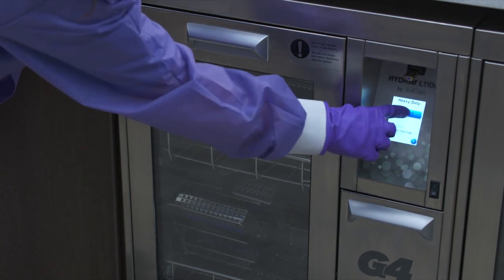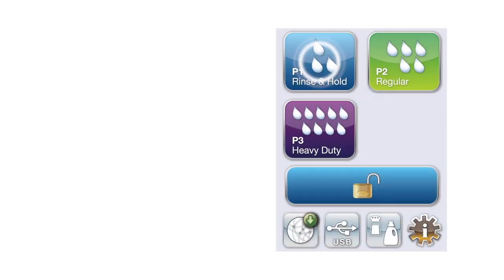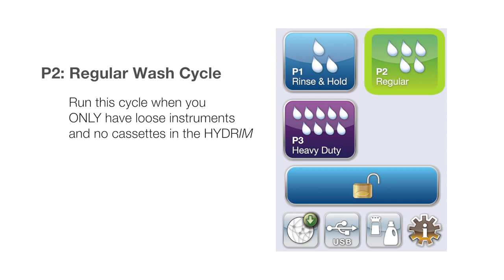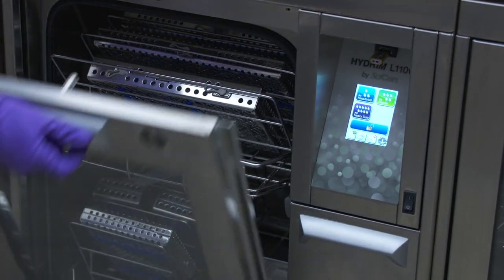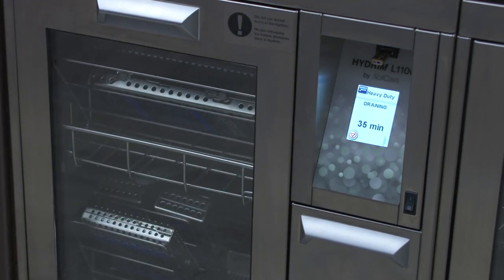Make sure you hear a solid thump as the door closes. The Hydrum comes with three pre-programmed cycles: P1 Rinse and Hold for rinsing off heavy debris or keeping instruments wet; P2 Regular Wash Cycle, for loads with only loose instruments and no cassettes; and P3 Heavy Duty Wash Cycle, designed for washing loads with instrument cassettes. For a full load, select P3 Heavy Duty Wash Cycle and press the Start button to begin the cycle. You will see the time it will take to finish the cleaning process.